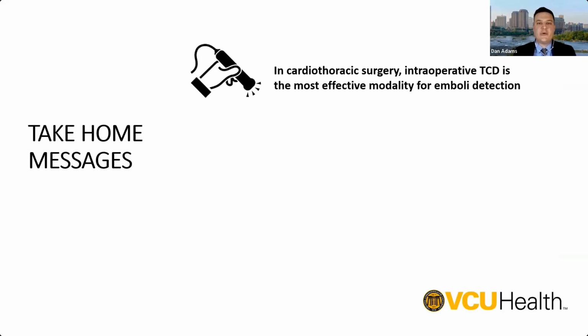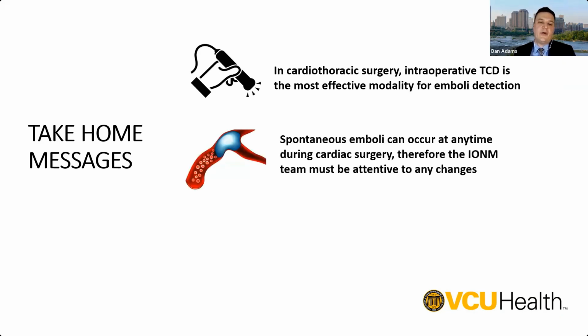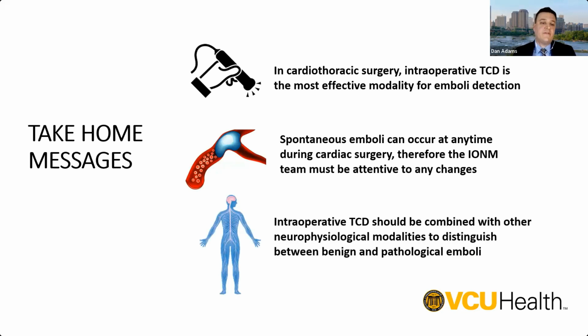So some of the key take-home messages we would like to share with you all today are that in cardiothoracic surgery, intraoperative TCD is the most effective modality for emboli detection. Also, spontaneous emboli can occur at any time during the cardiac procedure. Therefore, the intraoperative neuromonitoring team must be attentive to any and all changes that can occur throughout the entirety of the procedure. And intraoperative TCD should be used in combination with other neurophysiologic modalities like EEG, evoked potentials, and NIRS to distinguish between benign and pathological emboli.